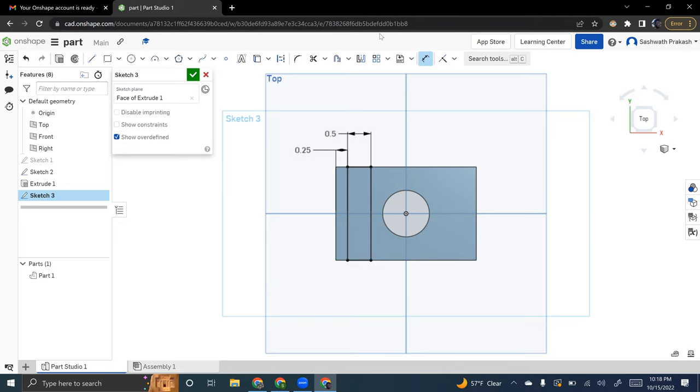Now that you've clicked that, we can make a rectangle. We're going to click the down arrow and click corner rectangle. Good. Then we're going to start from the top edge, a little bit over to the right, and click on the top edge. Start roughly over here and click once. Then drag your cursor down to the bottom edge, really anywhere on the bottom edge. That looks good.